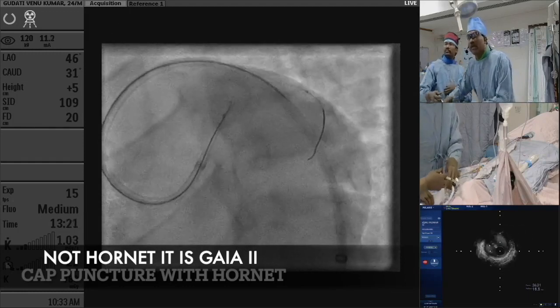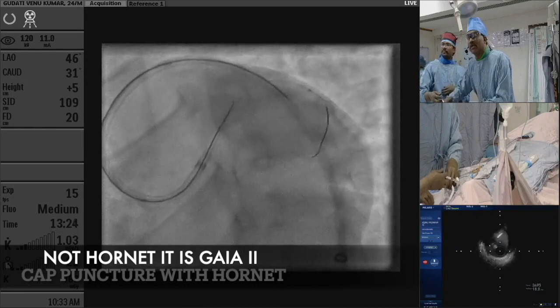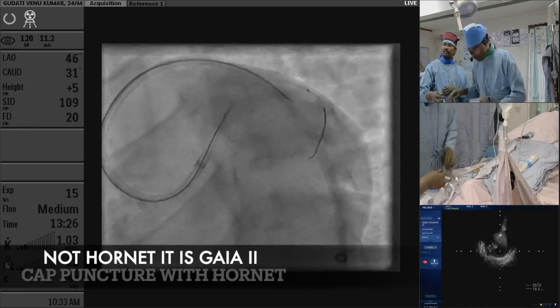You're recording. Okay. So you can see now it is perfect.